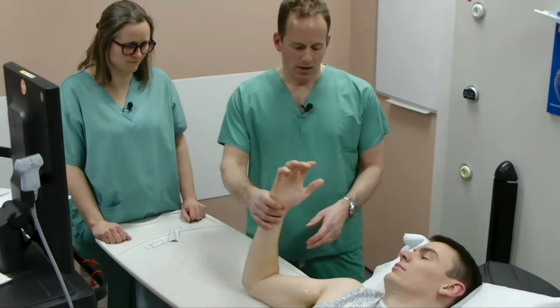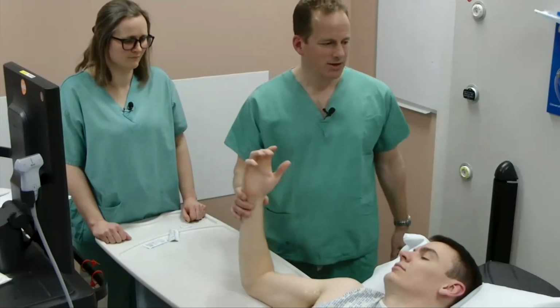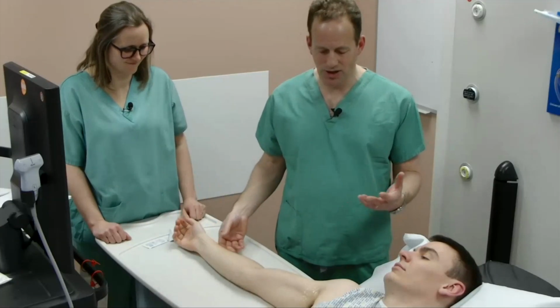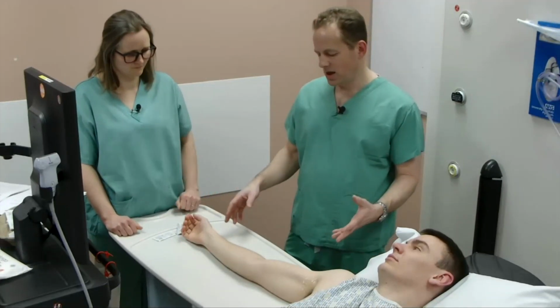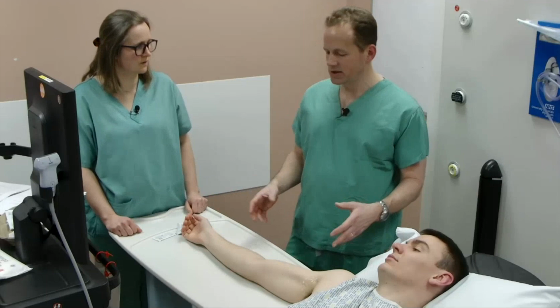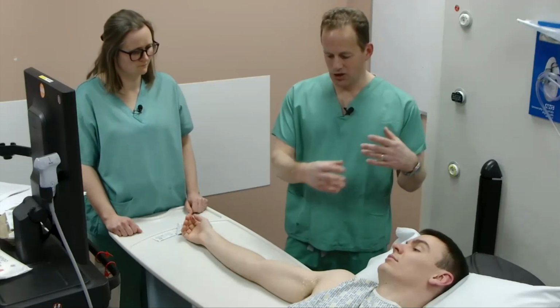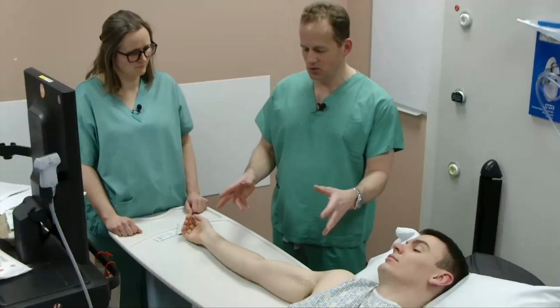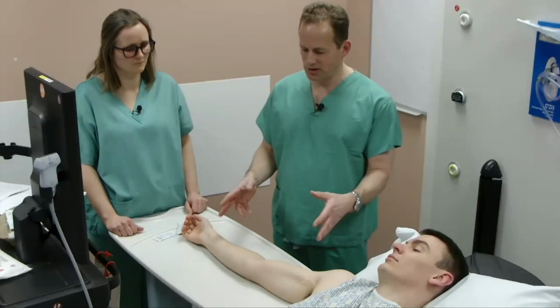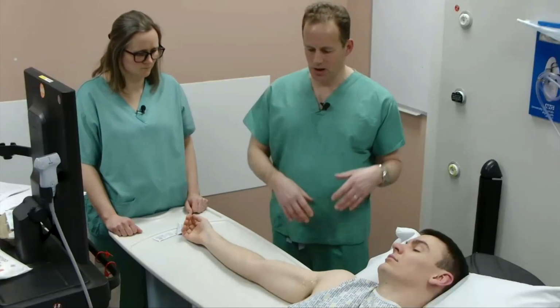So it's pull, push, pinch, pinch is the motto. And it's crude enough to work, just to check. And then I don't really test it after that, to be honest. I don't wait. I do my block, I check that, and generally, within probably 10 minutes from when you've started doing things, there's something happening. And then I know that the local is starting to work, and I take them in.